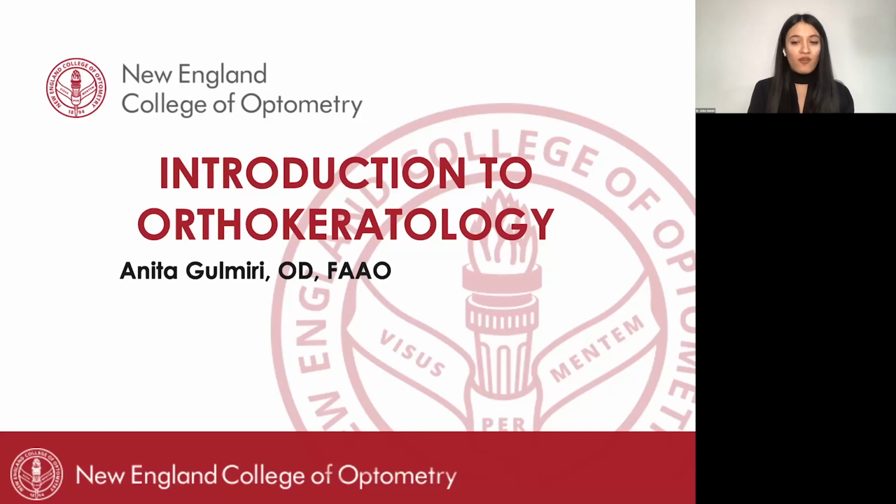Today, I'll be going over a very brief, surface level introduction to orthokeratology, which in my clinic is a fairly popular treatment for those that wish to be independent of actual visual correction, such as glasses or daytime soft contact lenses, or others that do not want to undergo refractive surgery. So, like I mentioned, not only adults, but we're also fitting children.